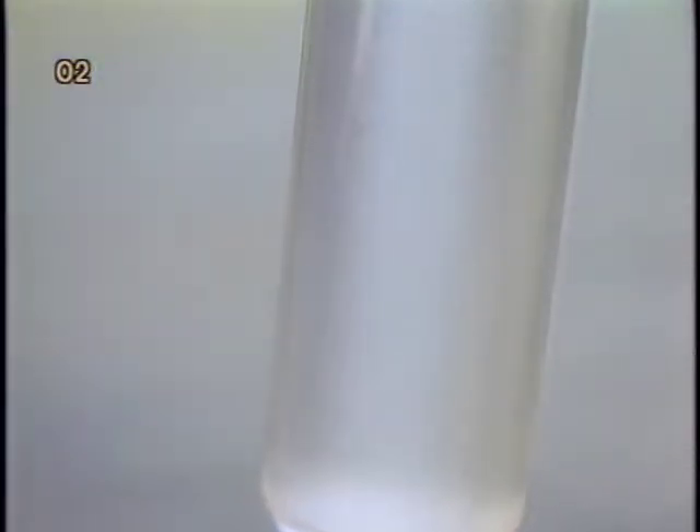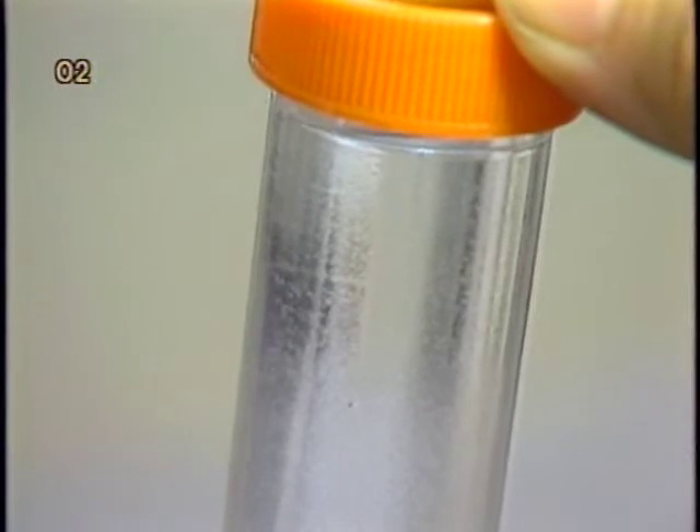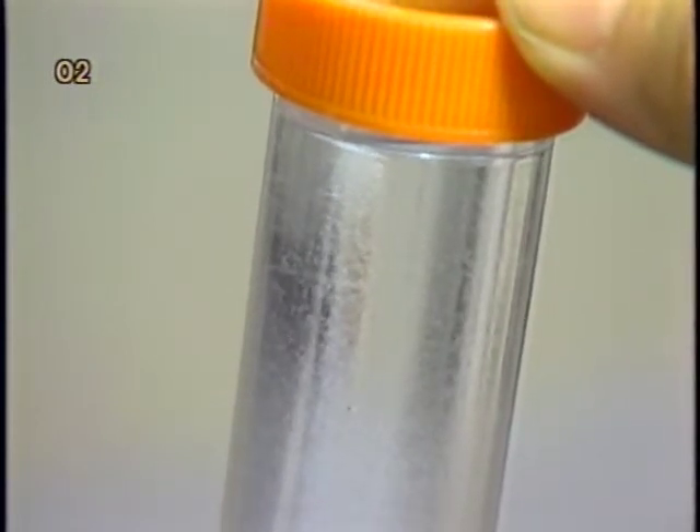Since microcarrier beads are suspended in PBS, they are usually rinsed with tissue culture medium to displace PBS before use. Otherwise, the PBS carried over by the microcarrier can dilute the cell culture medium appreciably.